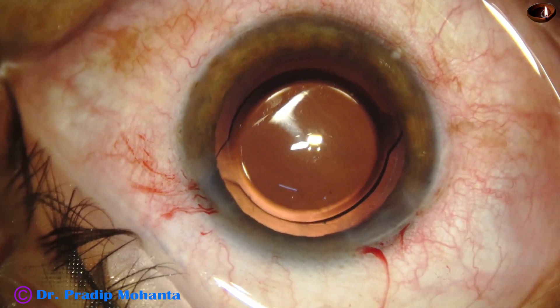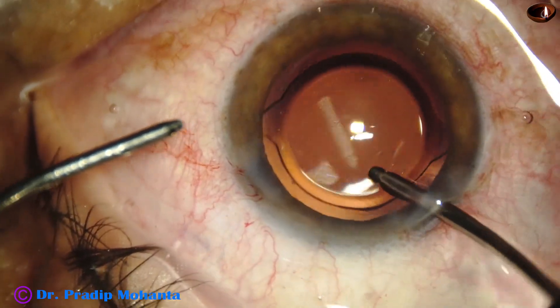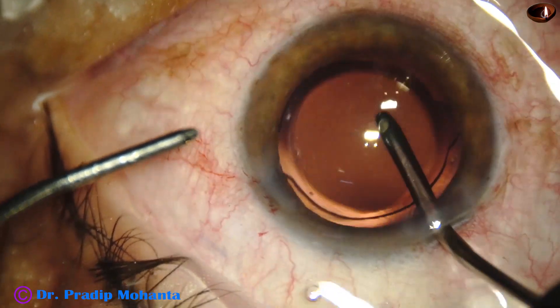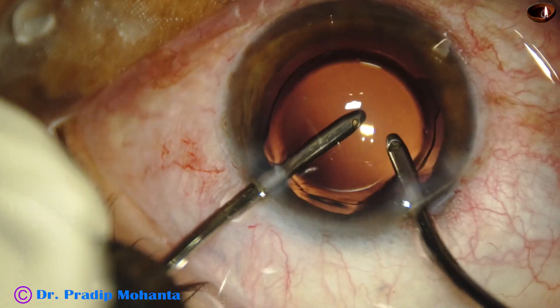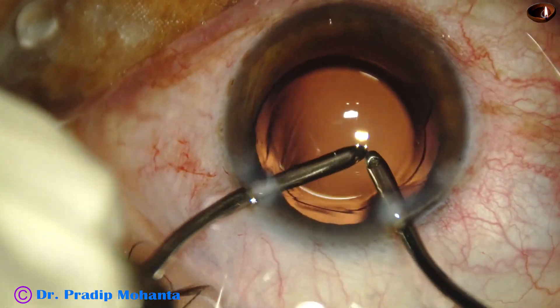First, the 23G Simcoe has been used. Now, this is bimanual irrigation aspiration. We must remove the visco that is behind the lens — that means between the intraocular lens and the posterior capsule, there is some visco trapped. We must remove that in all cases.